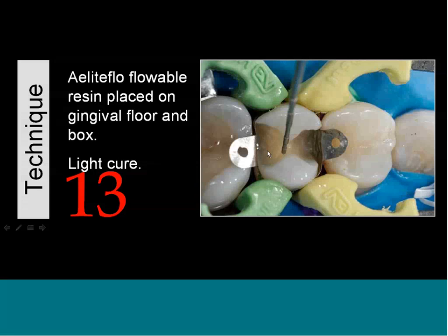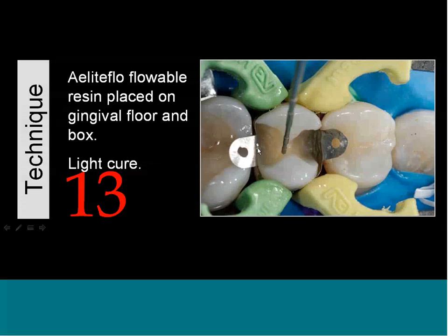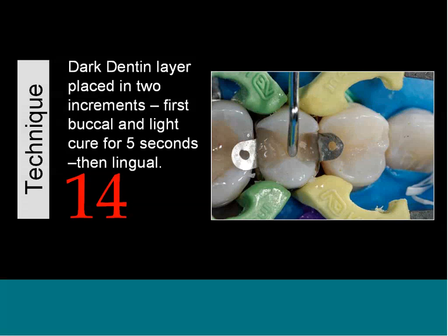And you want to be mindful, the deeper the preparations are, the longer it's going to take to cure this, simply because of the distance. So there's a big difference between having a preparation that's a millimeter deep, and these may be, say, 5 or 6 millimeters from the cavosurface margin all the way down to the gingival margin in the proximal box, and that's a long way for the light to go. So you have to adjust accordingly. If they're deeper, you have to cure longer.